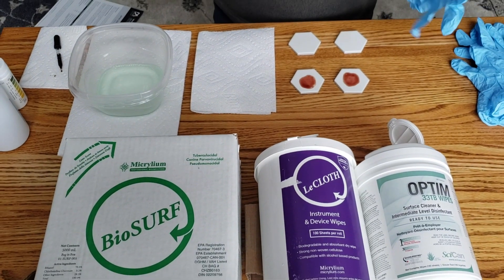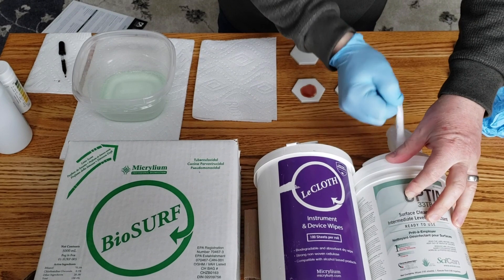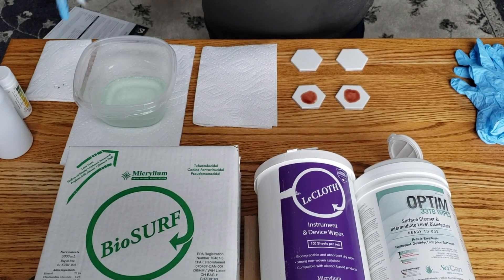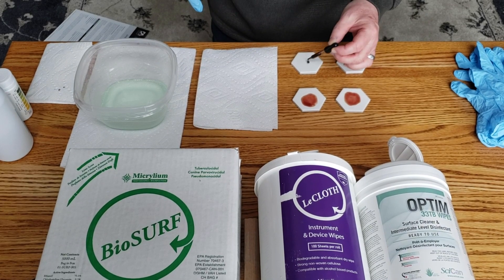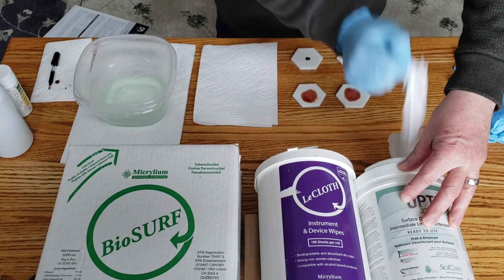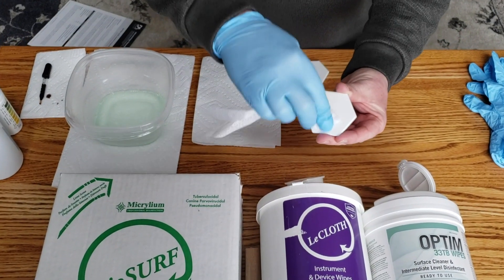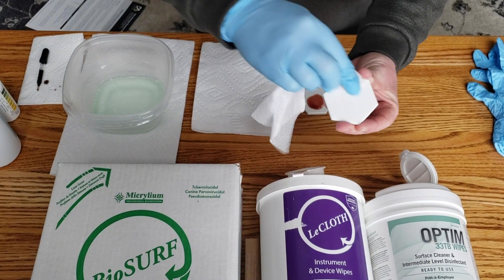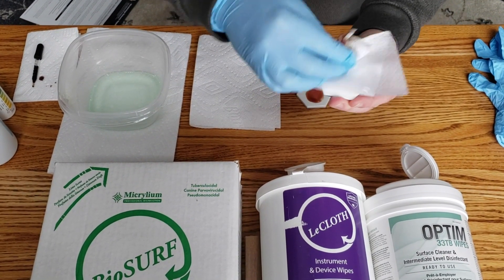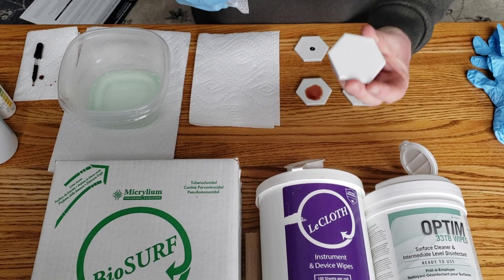I'm going to start with the Optum. I'll take an Optum wipe and contaminate the surface with one drop of medical sheep's blood so it's nice and wet. Then I'll take a wipe and clean the wet blood first — wiping for a five-second count. No visible blood.